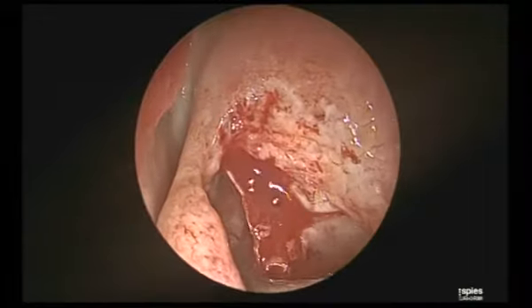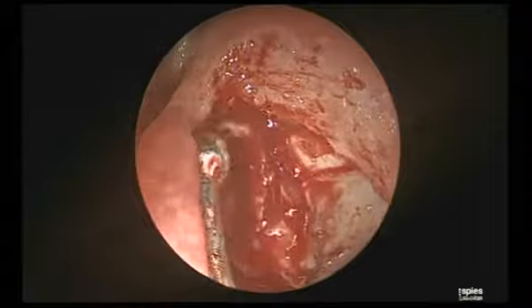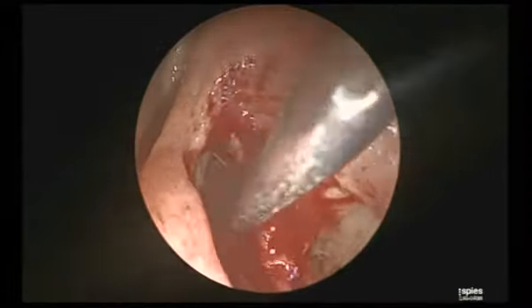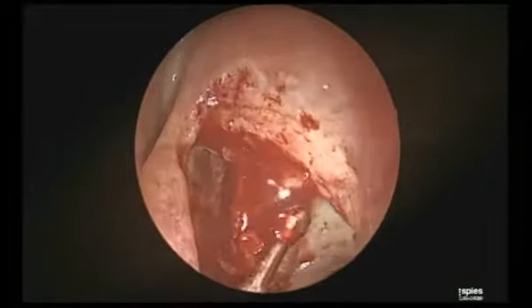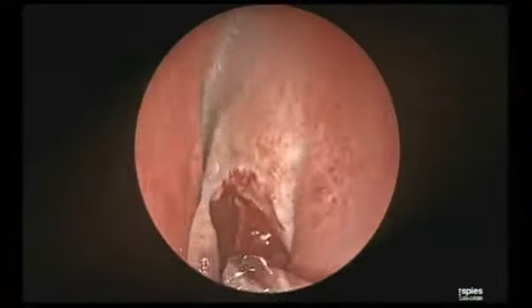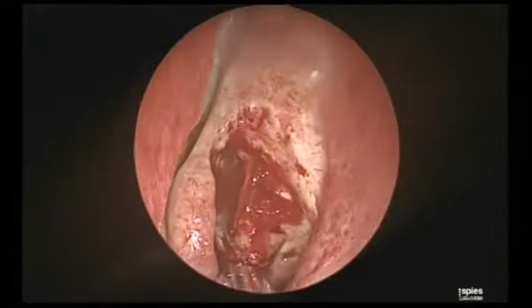Now what to do in the frontal recess: you have to get to know first through the CT scan the kind of cellularity there. There are two types of cells attached in the frontal region. The frontal recess is not like a duct, it is determined by the anatomy of the surrounding cells. So there are cells which are attached to the anterior wall of the frontal recess, and there are cells which are attached to the posterior wall.